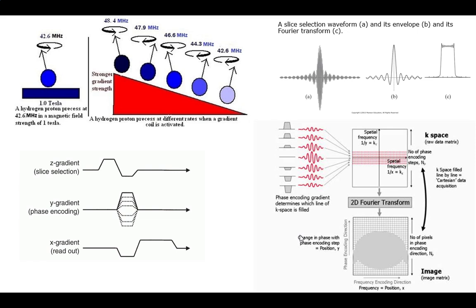only the one that's at that frequency will respond. The other ones are out of sync with it, and so it's not going to respond to it. So they won't really have any decent amount of kick to them. So that's kind of a nice area.